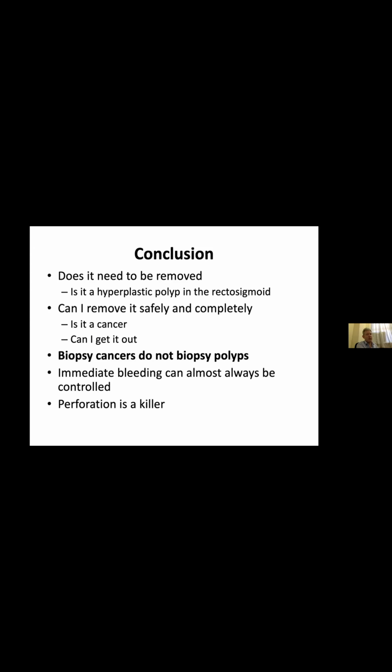While, as surgeons, we all have complications, unless you're people that do lots of large, big polypectomies, you may have the odd perforation. But I think for routine polypectomy, there really shouldn't be perforations. You've made an error.